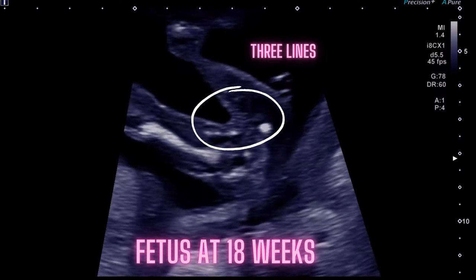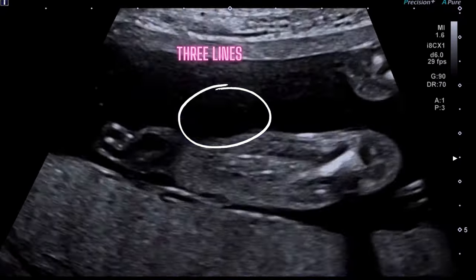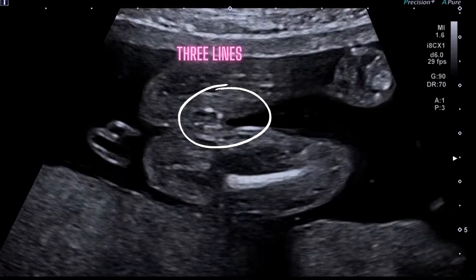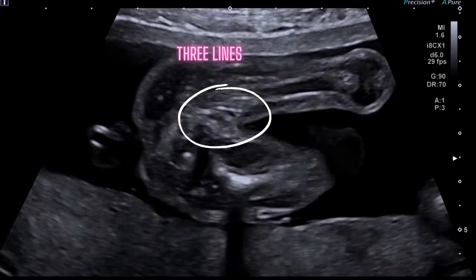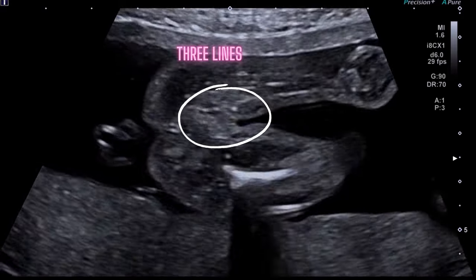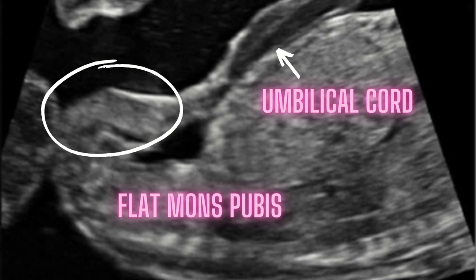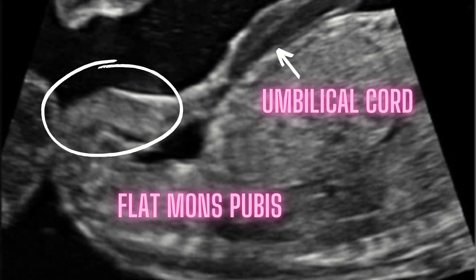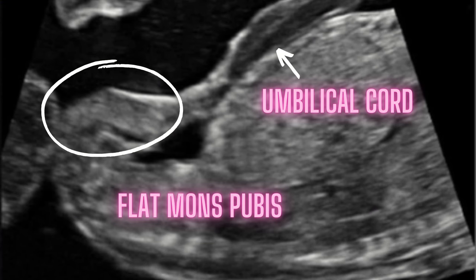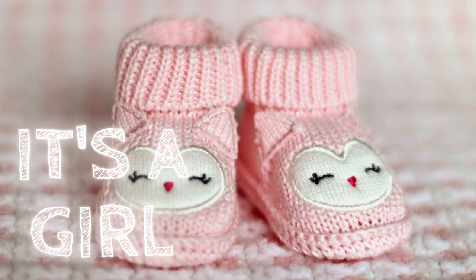This is an 18-week-old fetus. This is a transverse image taken below the bladder level. You can see the three lines between the thighs representing the labia. No male genitalia seen. Check it in mid-sagittal plane — you should see the flat mons pubis inferior to the umbilical cord insertion level. It's a girl.